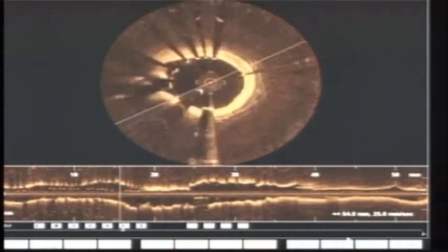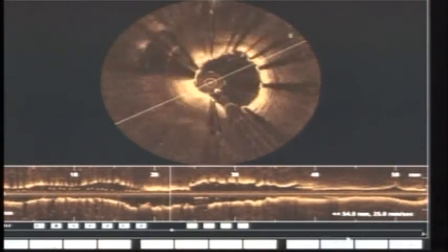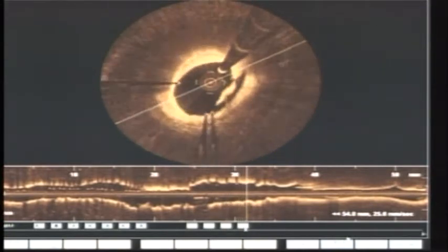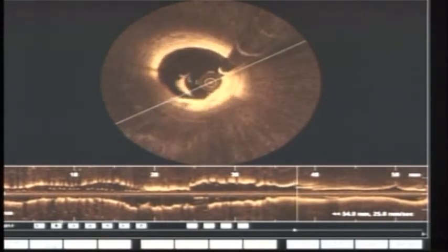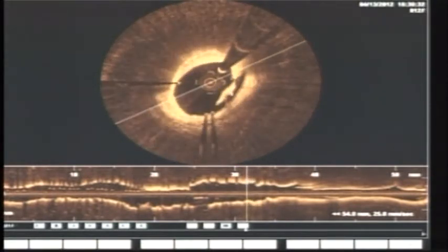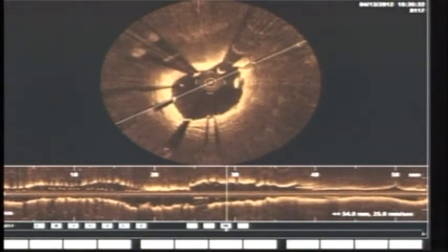Okay, so what you have there is the control run of the OCT for the circ. So far, I believe there's also good expansion, good apposition. There's kind of some artifact, isn't it, Daniel? Yeah, we have a lot of. It's interesting, the last section. So either it's a prolapse of tissue or... Yes. Yeah. These are still struts.